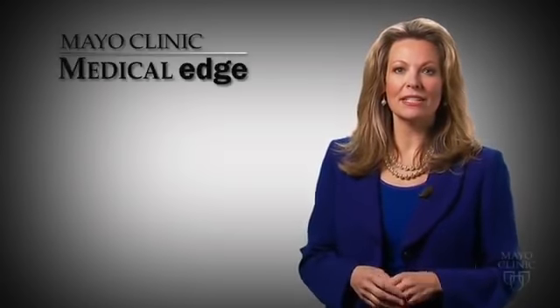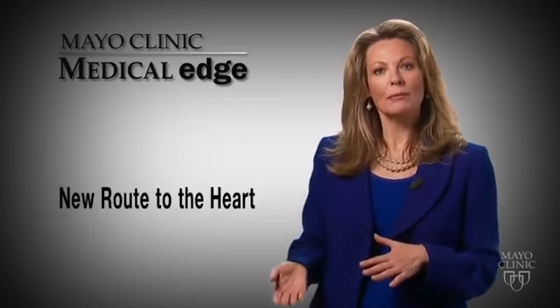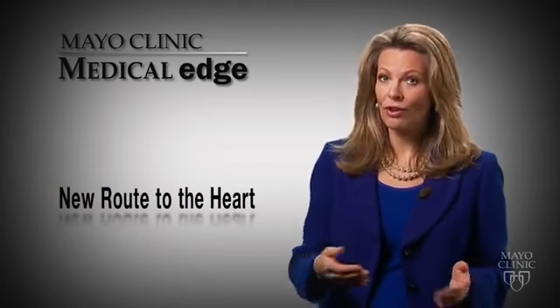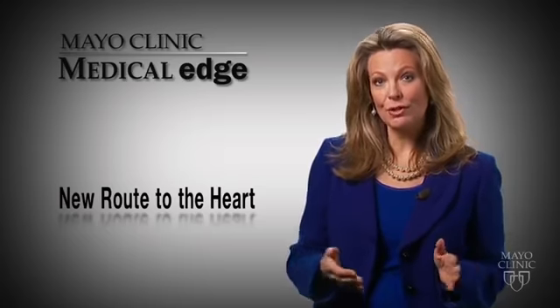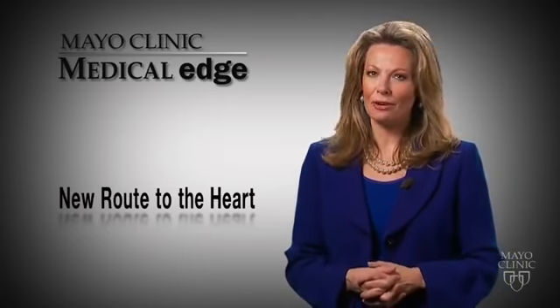Dr. Gulati says if you need a stent, there's no guarantee you can have the radial artery procedure. Only people who have good blood supply to their wrist and arteries that aren't too small are candidates. Also, some people who have bypasses can't have the procedure because wrist arteries are sometimes used in that operation. But for the right person, this procedure can be very beneficial.